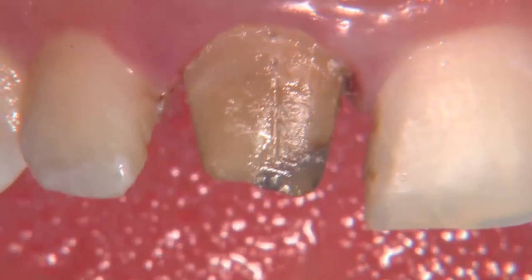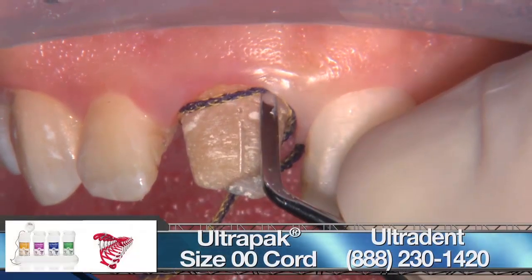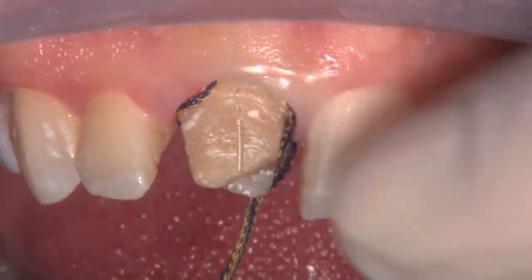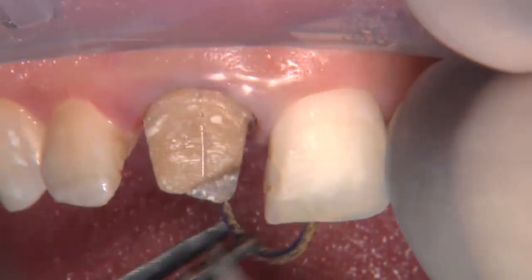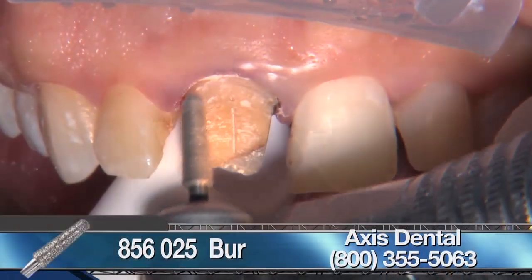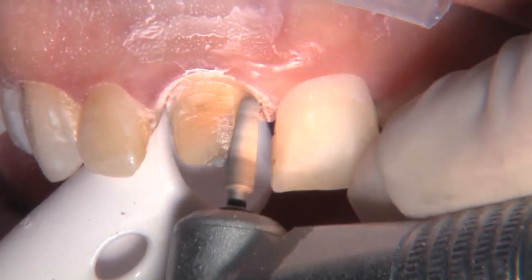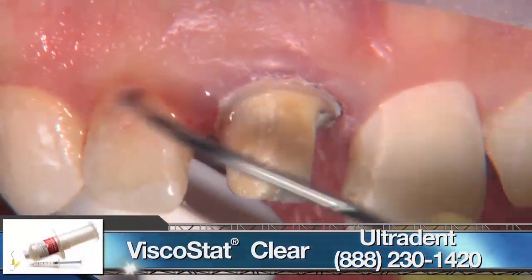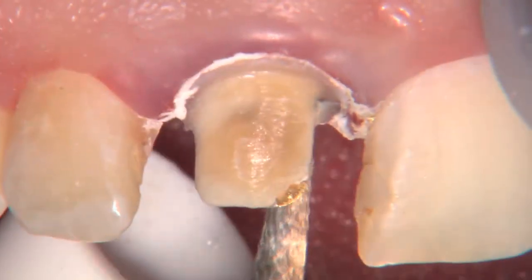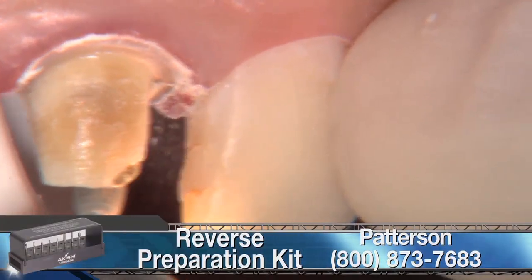You just rotate with the crown remover back and forth and it just falls off. If that was a Bruxer crown, I would have had to cut it two or three more times to get it off. You can see that it's been endodontically treated and that looks like the tip of a gold post at the incisal edge. We're going to start by putting our first cord in — this is a double zero ultra pack cord from Ultradent. These preparations where you're not starting from scratch, where you're taking off a crown already shaped — you can see it's a little over-tapered and most of our preparation is in the apical third. There's my favorite burr, the 856025. I've got the speed turned down to 2000 RPMs doing most of this reshaping dry.